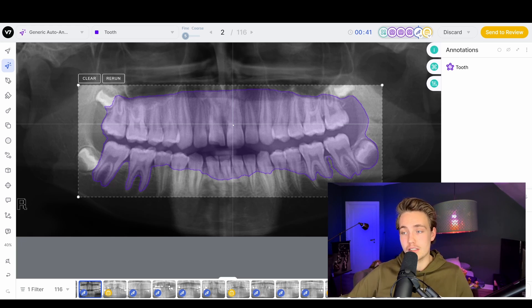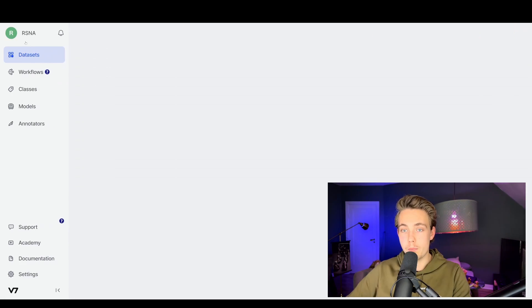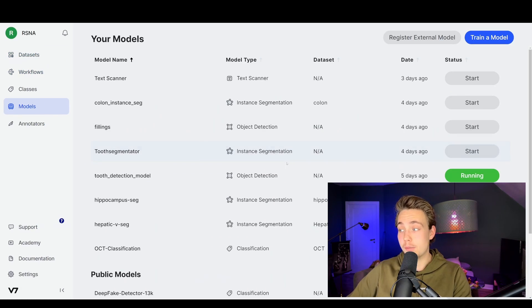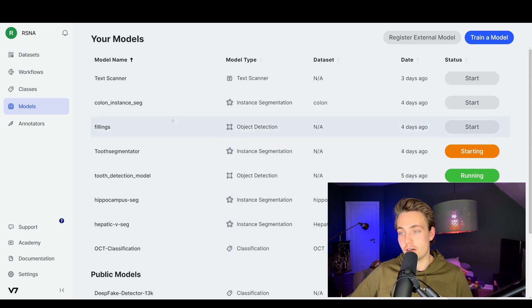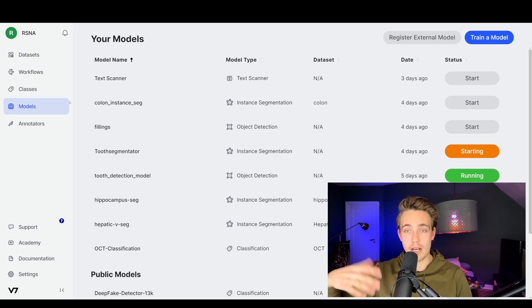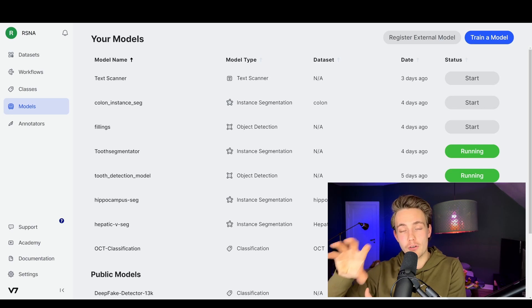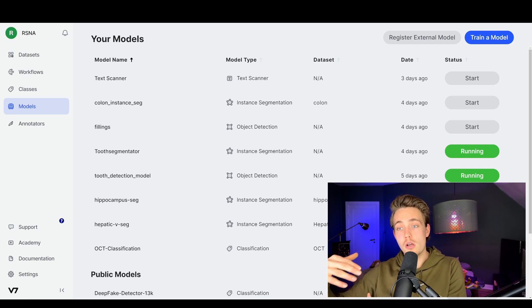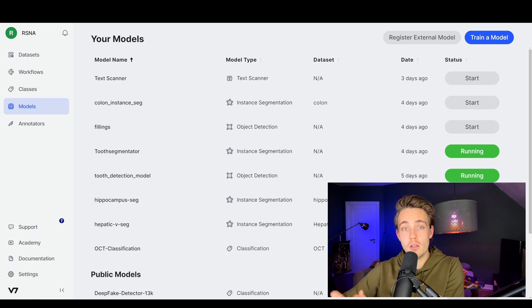This can be used for a lot of different things, like finding the length of a tooth. I'm going to delete this auto annotation and go back. Then we can go down to the models and start the tooth segmentator to segment out teeth in our image. You can also train your own models here with V7 and deploy them. You can create workflows as well, as I've showed in previous videos - take your dataset, pass it through an AI model first for labeling, then throw it into a review stage. If accepted from review, throw it into the complete dataset; if rejected, go to manual labeling, correct the changes needed, and then add to the final dataset.